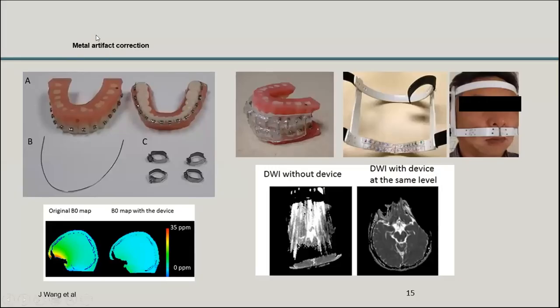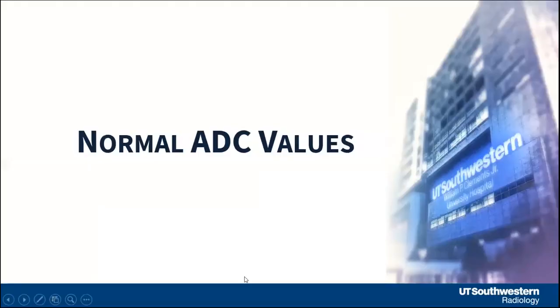Now, there's something about metal artifact reduction. Jerry Wang, in our setup, basically came up with this. He said if you put a permanent magnet outside the brain or outside the face, that's going to attract all the metallic stuff you have in your body. So if you have dental hardware and things like that, this will attract all that artifact. What ends up happening is the bad diffusion becomes a good diffusion. That was quite innovative. Right now we're working in the spine area: how can we reduce metal artifact in the spine?